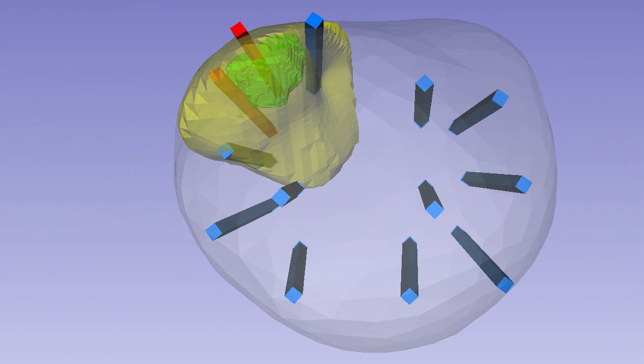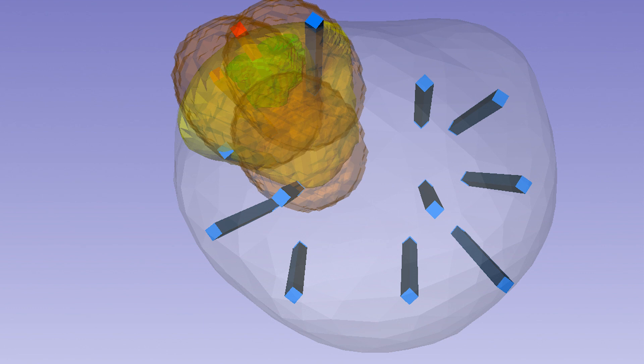Next, laser positions are chosen to encompass the treatment margin. Each ablation has a maximum diameter of 18 millimeters, which is overlaid on MRI.